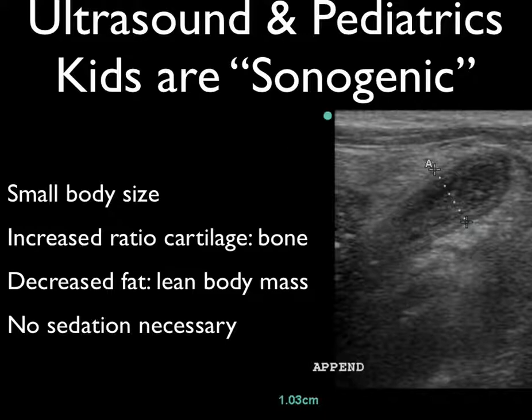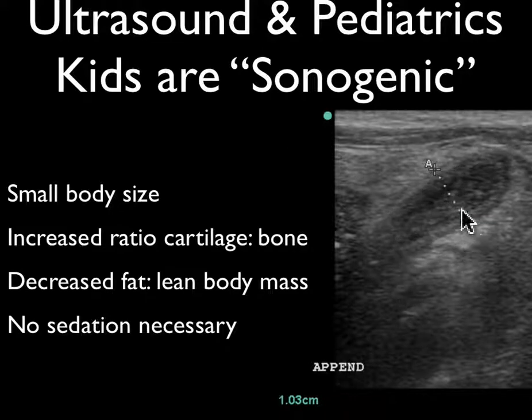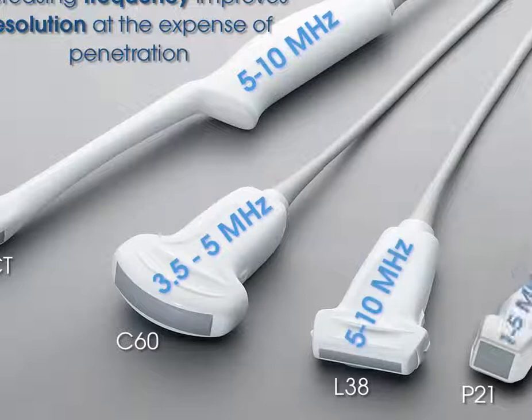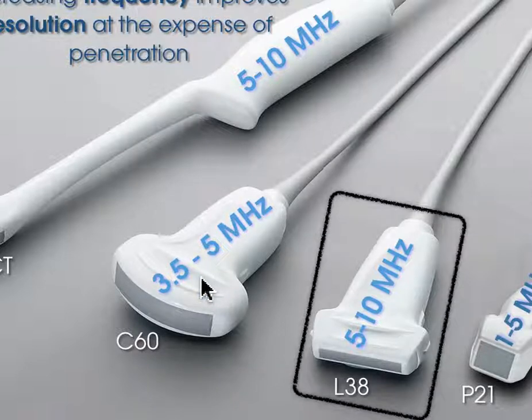Here is an example of a patient with appendicitis. This is the skin line up here, some muscle, and this is the appendix swollen right here — it's greater than six millimeters, wall-to-wall measuring 1.03 centimeters. That's what acute appendicitis looks like. Which probe do we use? Normally when we look in the abdomen on adults we use the lower-frequency probe, but on kids we get to use the high-frequency linear probe — my favorite probe, because it makes such pretty images.